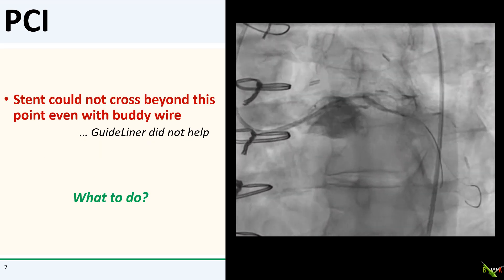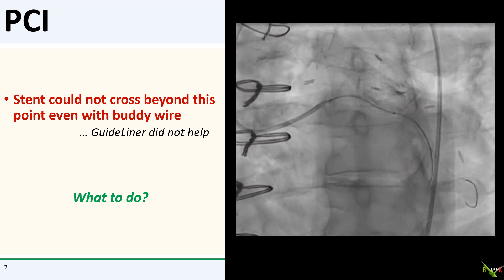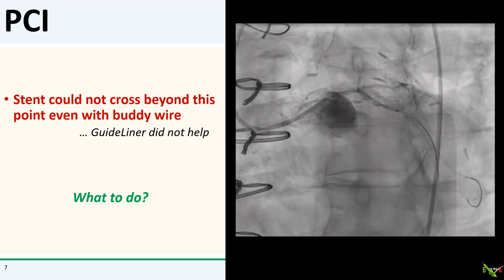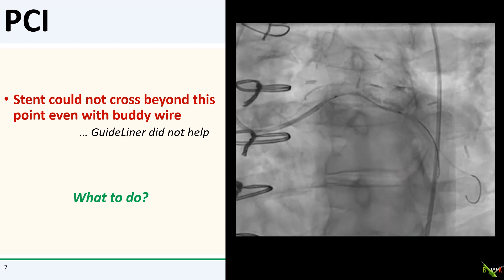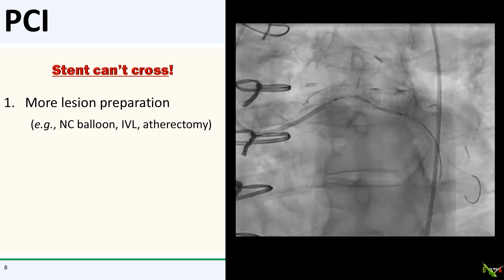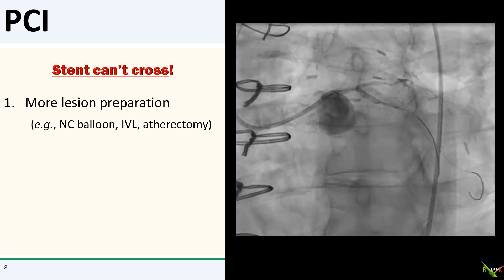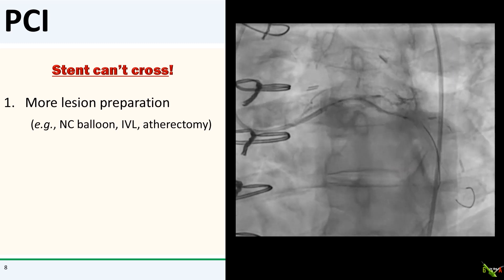But I could not get the stent to cross into the circumflex. This is where it keeps getting stuck. A guideliner did not help and did not get the stent any further. What to do?